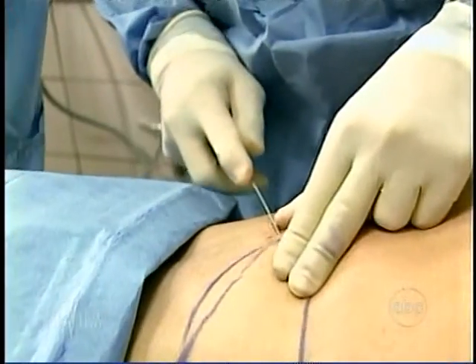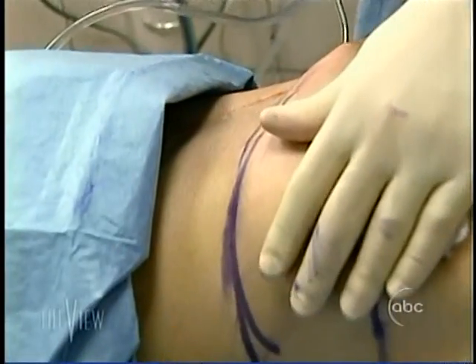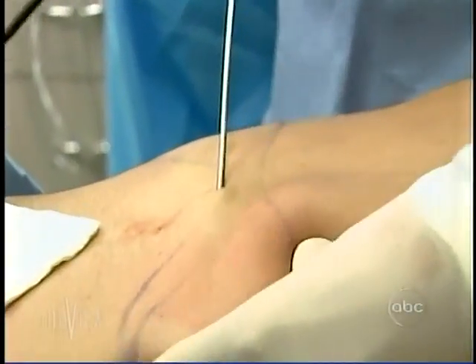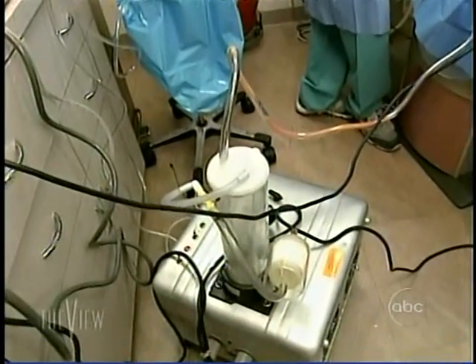Why is it called power liposuction? Well, we use a very small cannula that moves back and forth. It's actually motorized and moves at about 3,000 strokes per minute. So it's completely different from traditional liposuction. Okay. And here you see it moving back and forth right there and suctioning out the fat. This probably looks like the largest procedure of all that we've seen so far. It's still a large area. But again, still very small compared to traditional liposuctions where we're taking away big abdomens, thighs, hips.